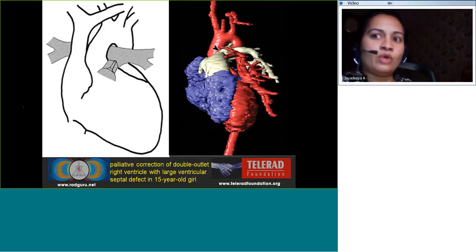Now, repeated progressive occlusion and reopening are possible with newer implantable devices which can actually behave like adjustable pulmonary arterial bands. So these bands can be occluded or reopened according to pulmonary arterial pressures that are desirable to be obtained.